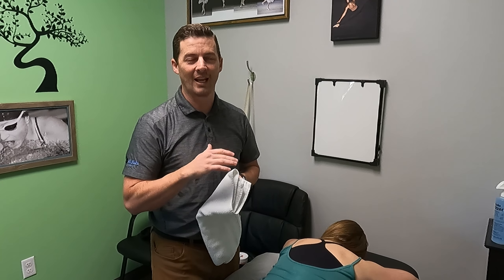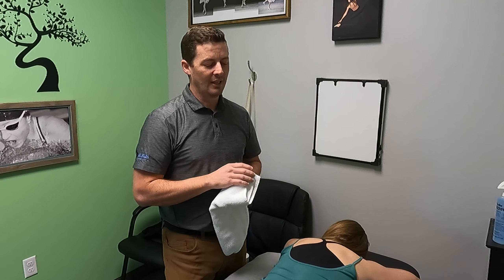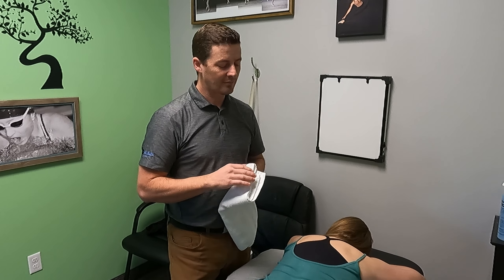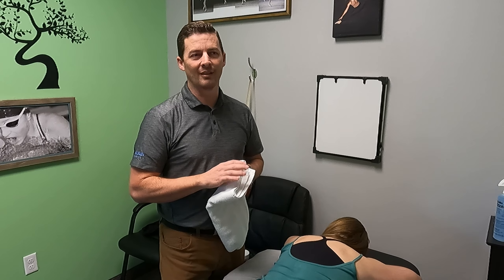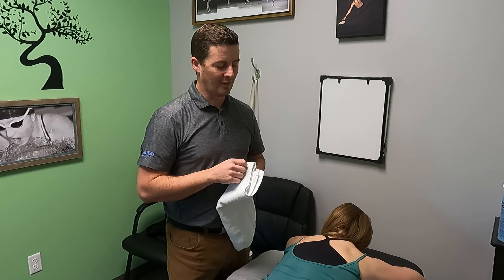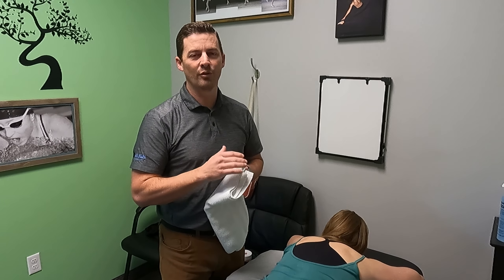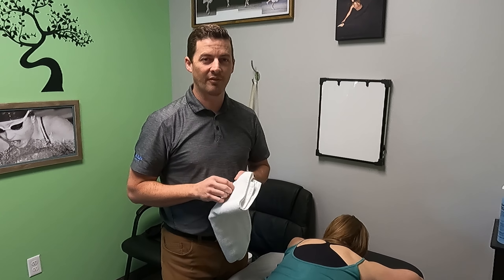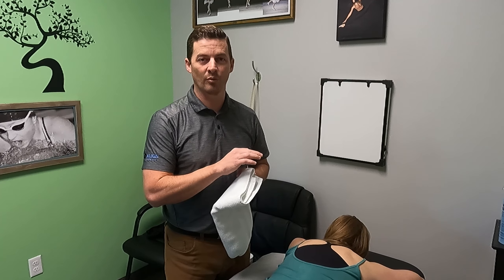Today I wanted to show how I do manual therapy using a technique called ASTYM — A-S-T-Y-M. It stands for Augmented Soft Tissue Mobilization. It's a specific manual therapy technique that you have to be certified in to do and to call it ASTYM. There are many other techniques that are similar, called IASTM, or Instrument Assisted Soft Tissue Mobilization.